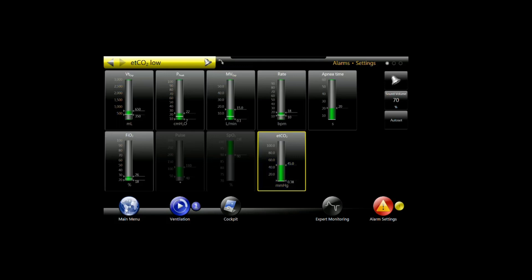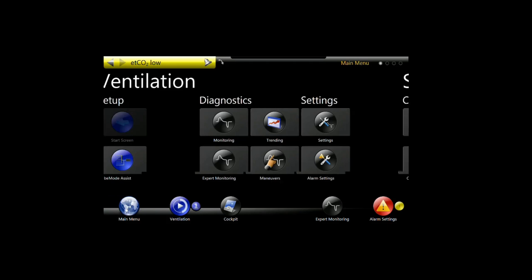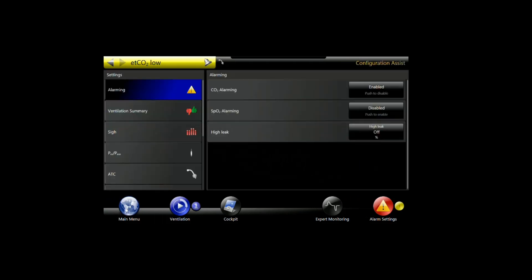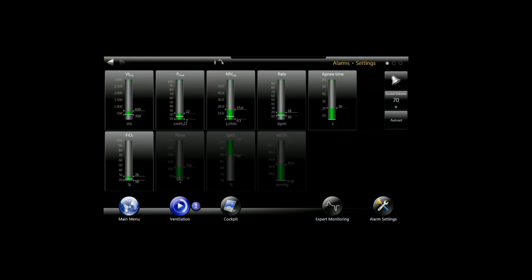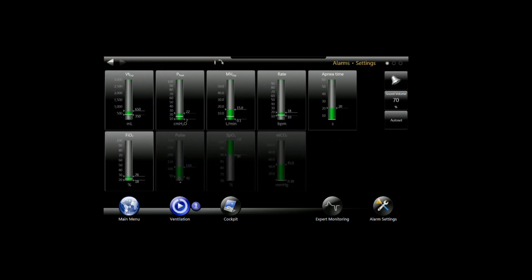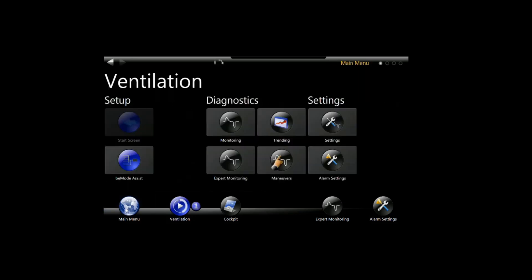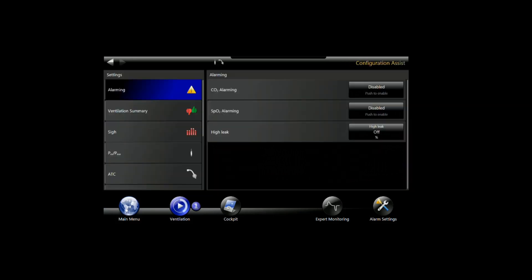If we go back out to the configuration assist screen and go into the alarms and we disable it here, and we jump back over to the alarm settings, you'll see that I can't actually set the alarm here. If you connect a sensor and you get to the alarm page to set an alarm and you notice that it's grayed out like it is on the display now, that means you need to go back out again to the main menu, to the configuration assist page, and actually enable the alarms here.